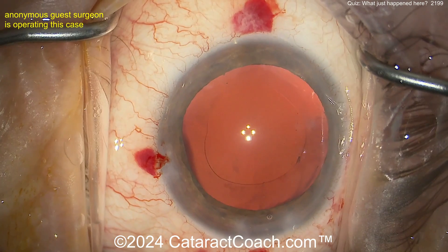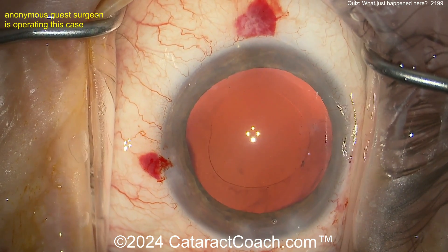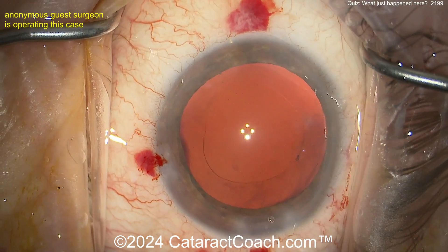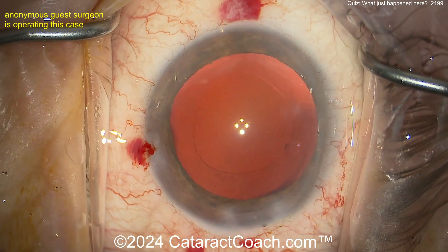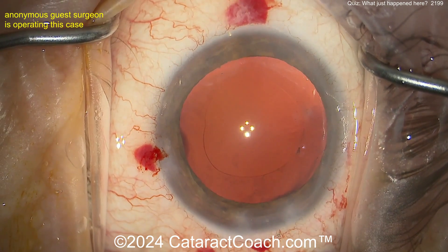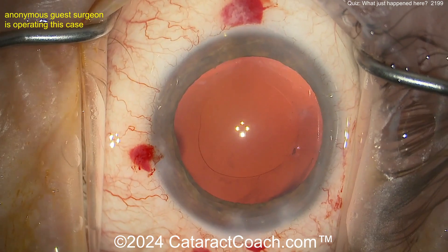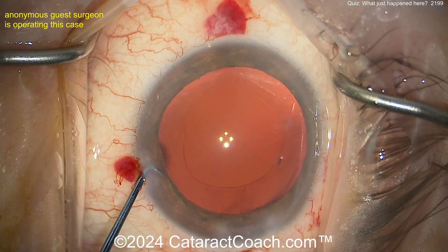Now let's get back to our case. It's going to put the lens in, and the question is: do you need a CTR? Tell me — do you need a capsule tension ring in this case? You saw what it was — maybe about two clock hours of zonular loss, maybe less than a quadrant. Can you get away without a capsule tension ring? Is there a downside of putting the CTR, or is there no risk — just put it in? What else could you do? Maybe put the lens in first and then decide.